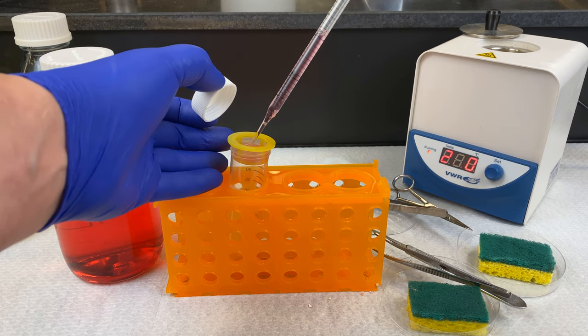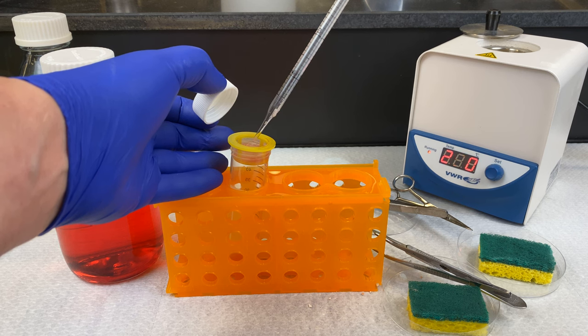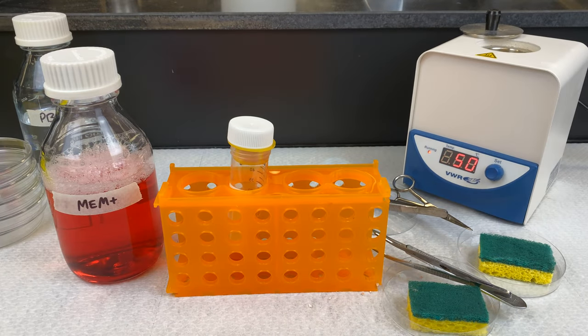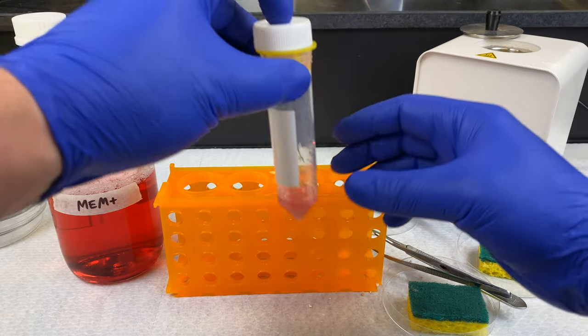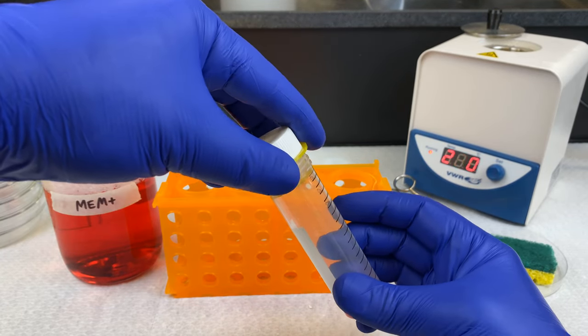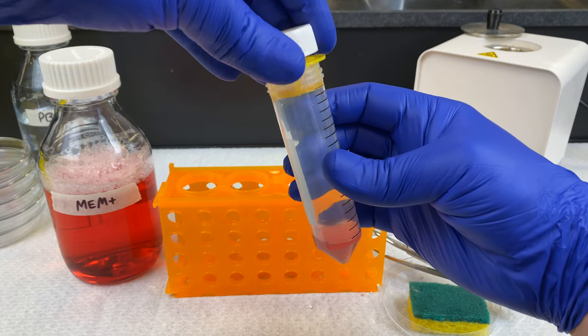Sometimes there's a bit of vacuum pressure that forms, so you have to lift up the side of the cell strainer. It depends on how much tissue is covering the cell strainer on the inside. If it's not flowing through, just lift it up a little bit — that'll break the vacuum seal and your cells will run through.